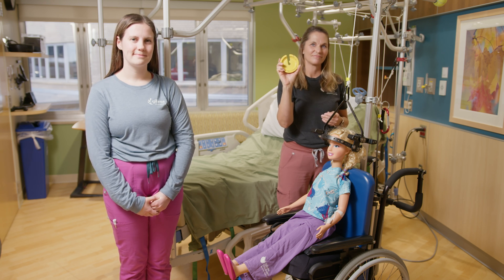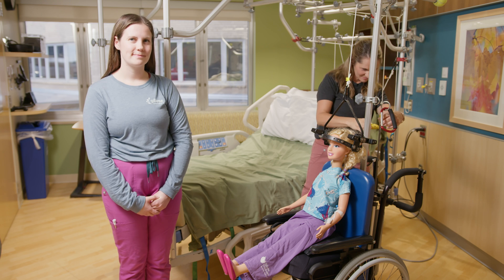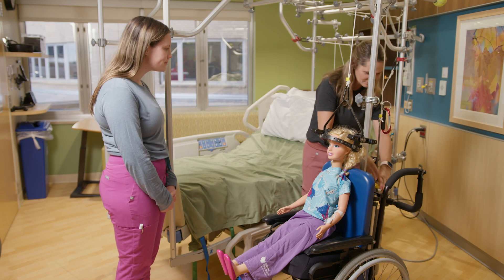It is as easy as putting this yellow weight onto the rope behind your head. We pay extra attention to make sure that every rope has the same amount of weight on it.